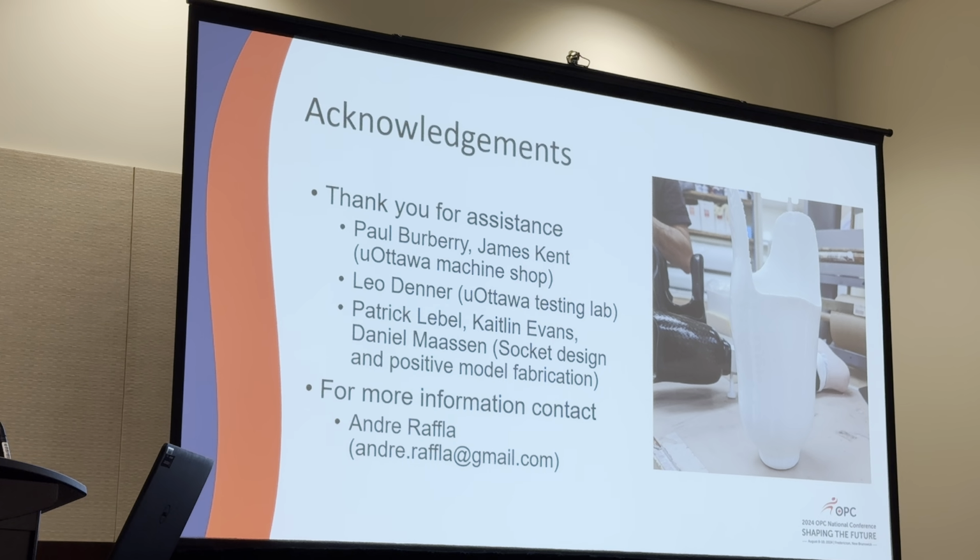Hi, really interesting presentation, thank you. I was curious, so this is meant to be used in conjunction with a liner, which is what you said? Yeah. So how does it get on? So like it'll be in the socket, then the liner? So the idea is that we will press fit the insert into the socket, and there's a small attachment at the bottom that they use already for sockets, and it would basically fix everything in place, and then they would use it as a regular socket after that.